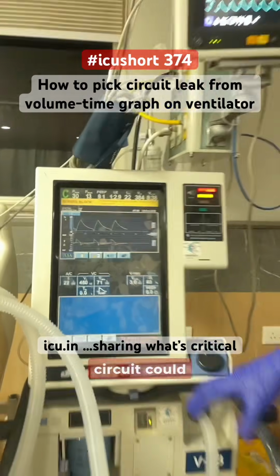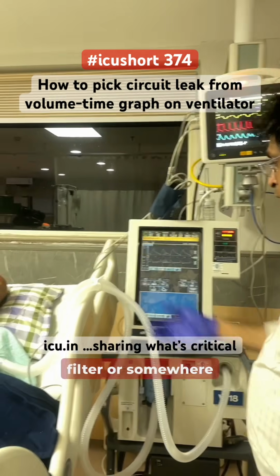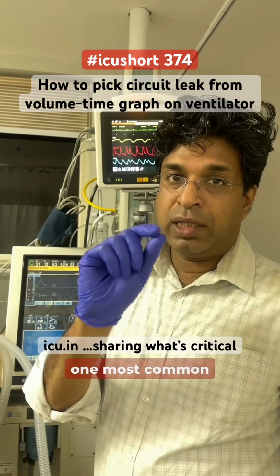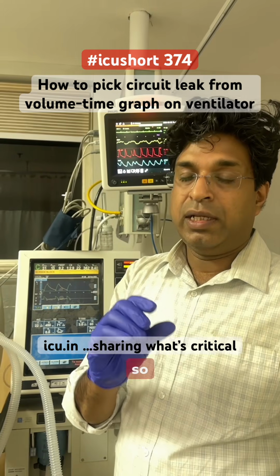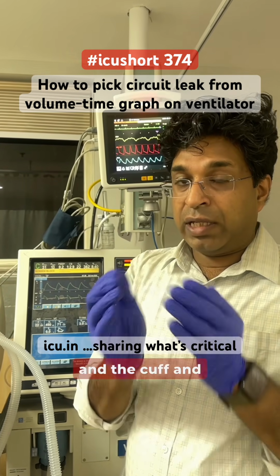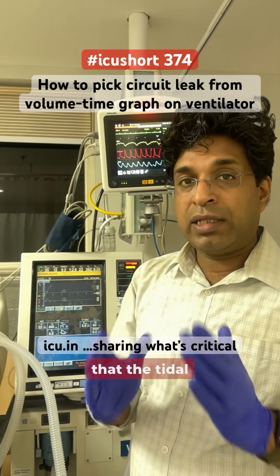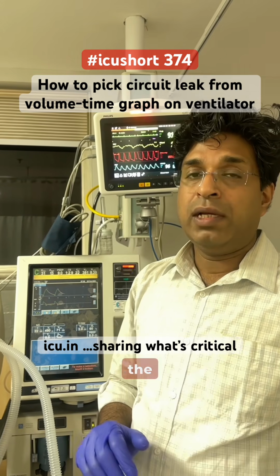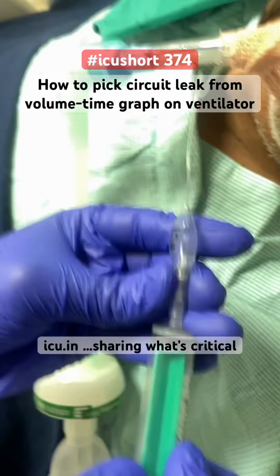The leak in the circuit could be anywhere. It can be in the limb or in the filter or somewhere else. But one most common thing which we forget is the cuff pressure. If the cuff is a little bit deflated, there becomes a gap between the trachea and the cuff, and the air leaks from there. That's why the tidal volume can leak from there and is not properly delivered to the patient. So I'll inflate the cuff and let's see what happens.